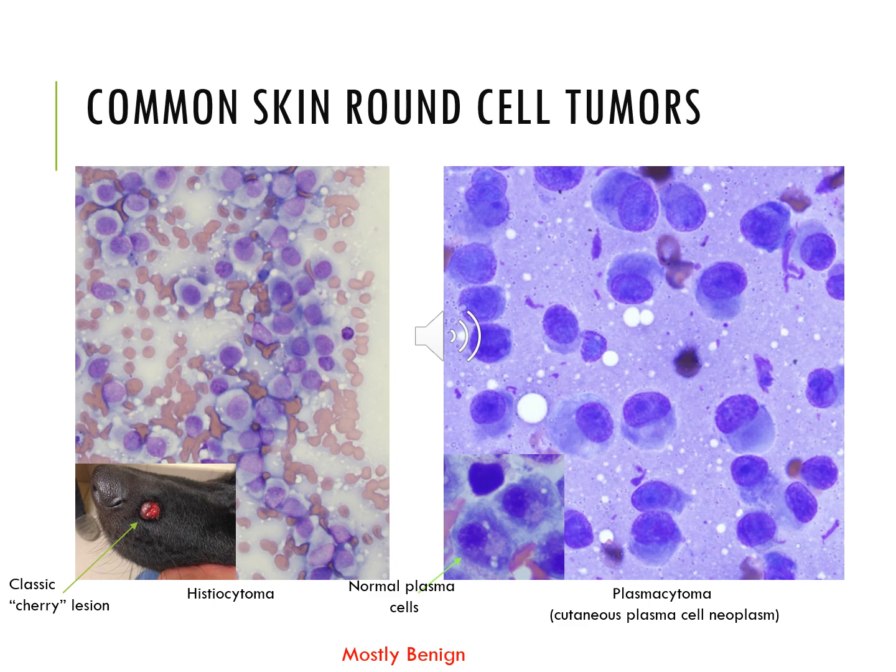And what we see cytologically is these round cells, which have usually a centralized nucleus. They have moderate to abundant, lightly basophilic cytoplasm, which sometimes can have scalloped edges. And then they can have what's called a cleaved nucleus, so it can be indented with a line down the middle, and that's something that you can see very commonly with histiocytomas.